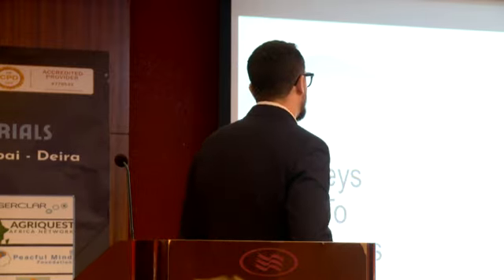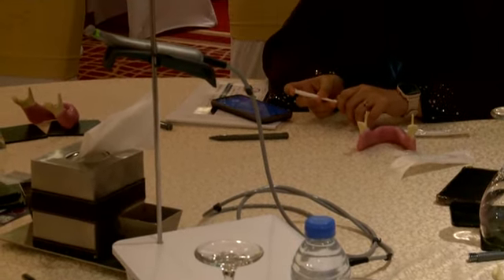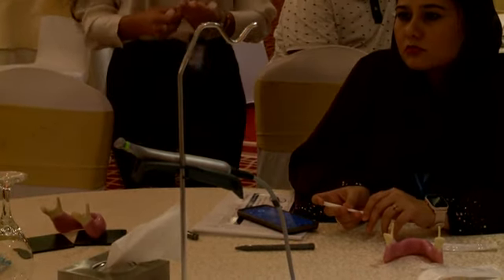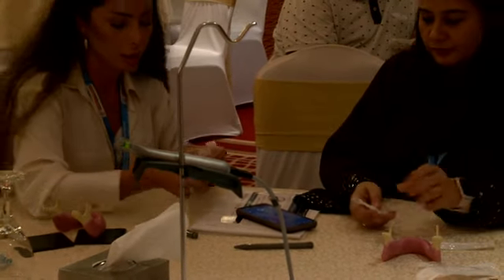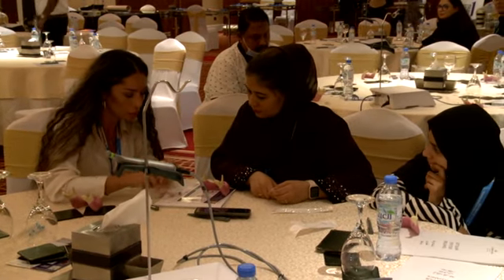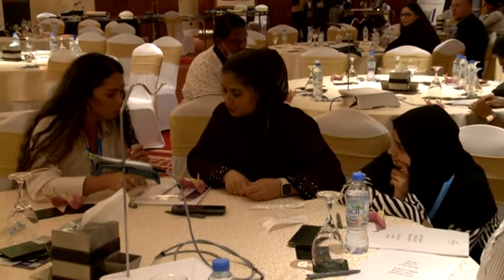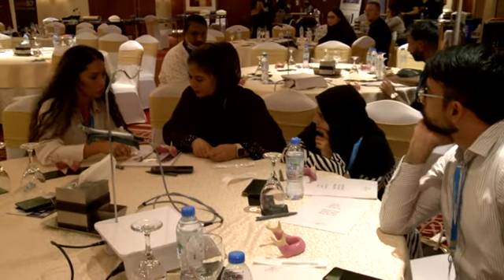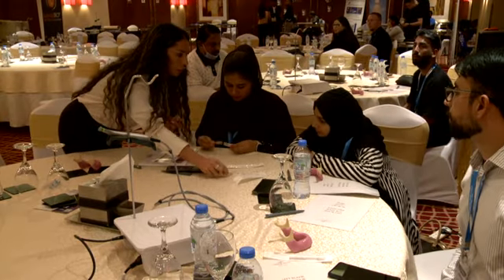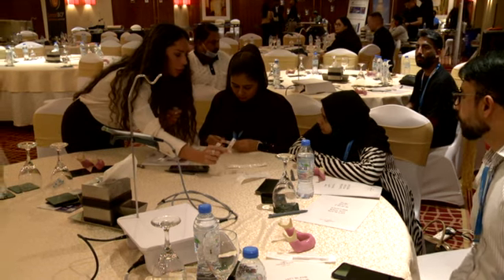If the patient doesn't want an immediate loading, you can use a customized healing cap that will always do the inhibition by contact process. Here, the diameters are so that you can identify the size of the implant you're going to be placing and take one size before, so you can undersize your osteotomy and then place your implant, right? For example, if you're going to place a 4.3 millimeter Nobel Biocare implant, your last drill in the sequence is going to be 3.7. Now, if you have hard bone, you're going to use a 4.2, not a 3.7, and be able to still engage your implant, right?